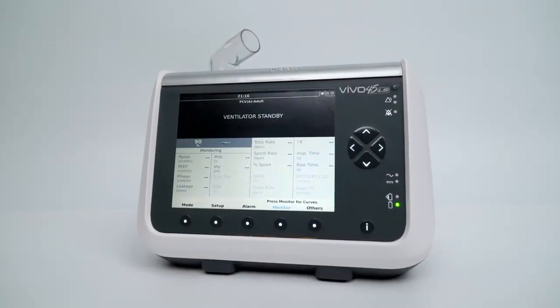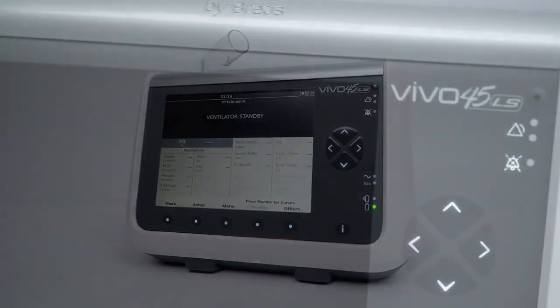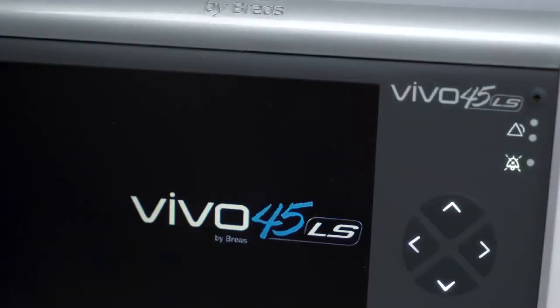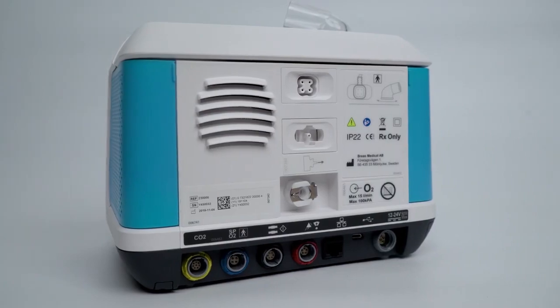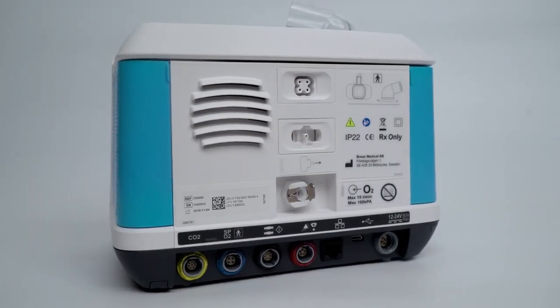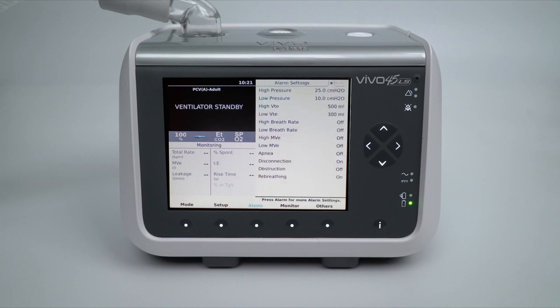Welcome to the Breas Vivo 45 LS tutorial series. In this video, we will be going through the alarm menu. To open the alarm menu, press the alarm function key. This will open the first tab or page of this menu.